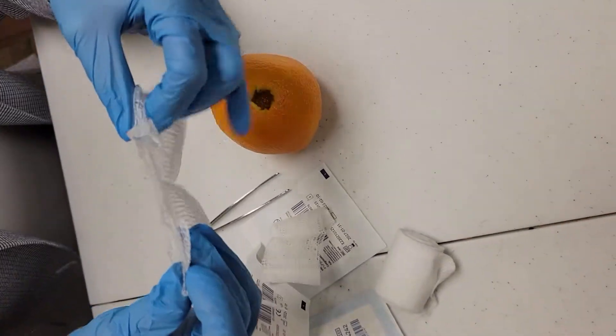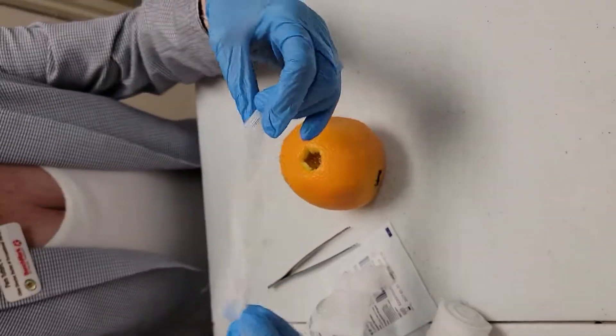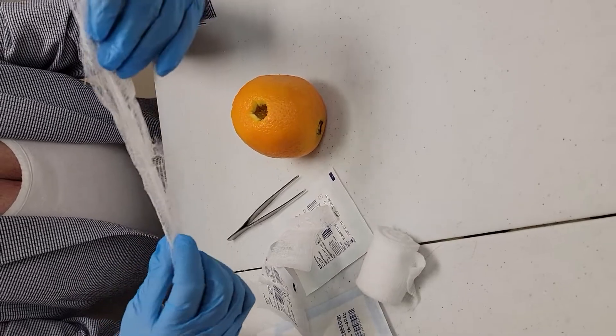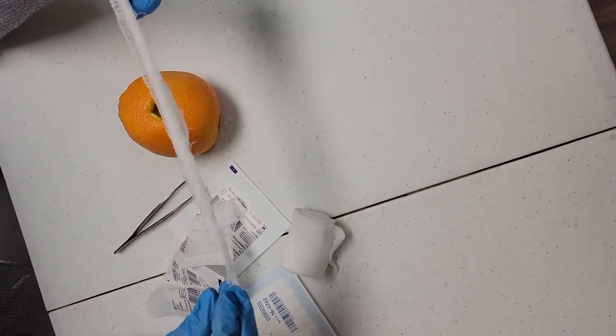I'm going to show you on a 2x2 and then I'll show you on a 4x4 if it's a bigger wound. So you take your sterile gauze and kind of open it completely and give it kind of an angle.